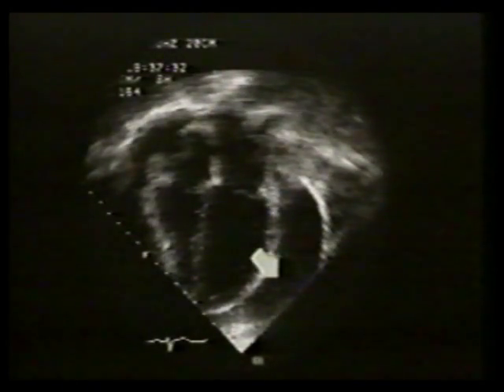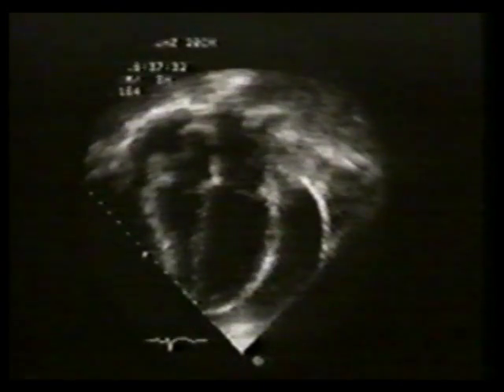This patient has a large pericardial effusion which proved to be hemorrhagic. Diastolic collapse of the right atrium is evident. In real time, diastolic RV collapse is also present.